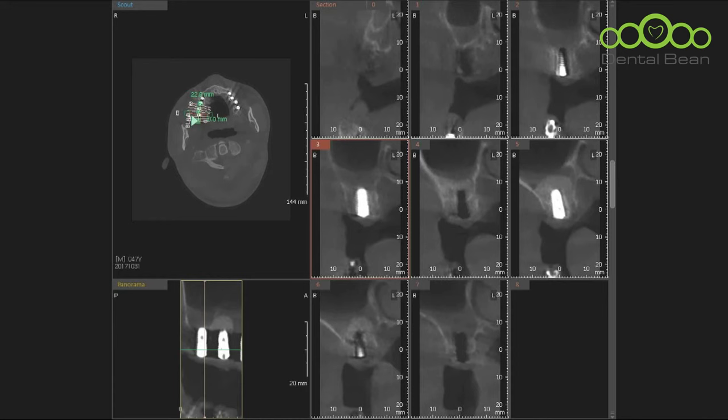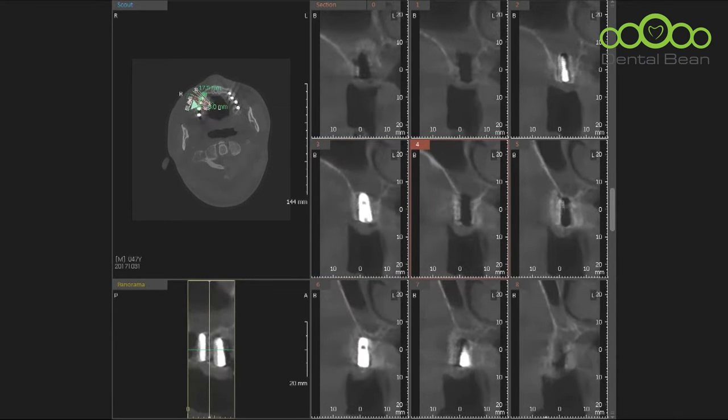Okay, next, premolar site. Okay, right premolar site. Sinus slightly involved, but not a big problem. And even though I tried the split, it was not well done in reality. I want to perfect the splitting, but not like that. The patient has very dense bone. I didn't give a vertical incision as a result. Still, it was not sufficient, so I tried GBR again.